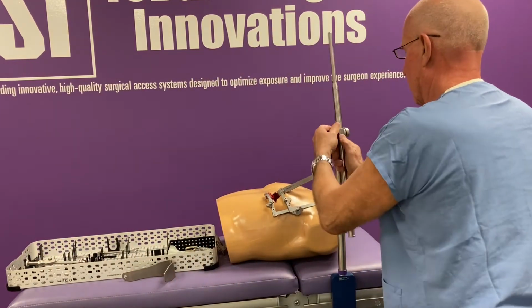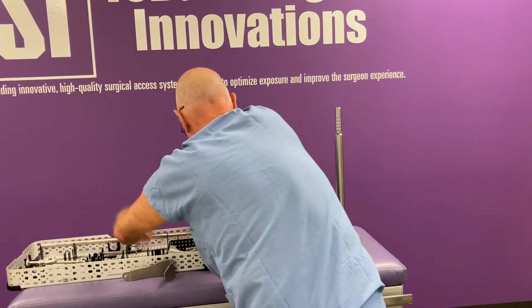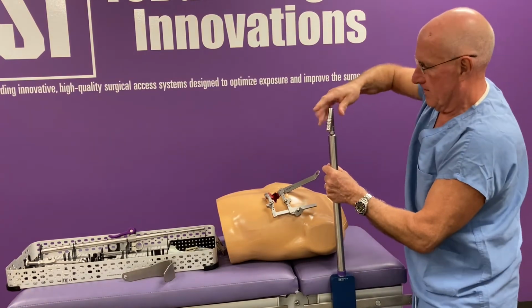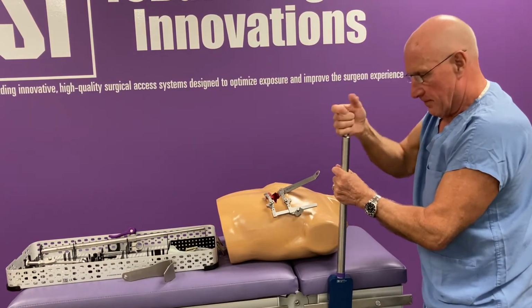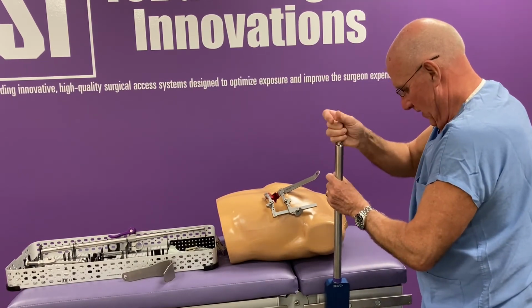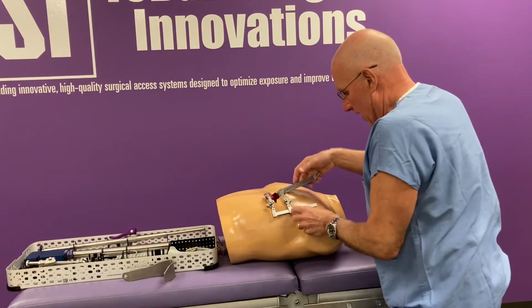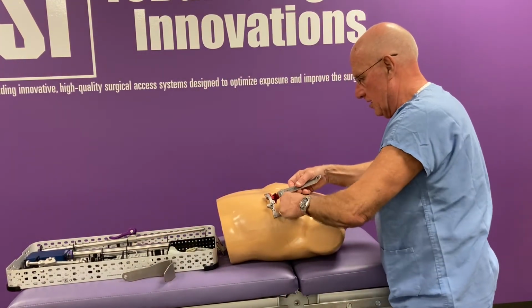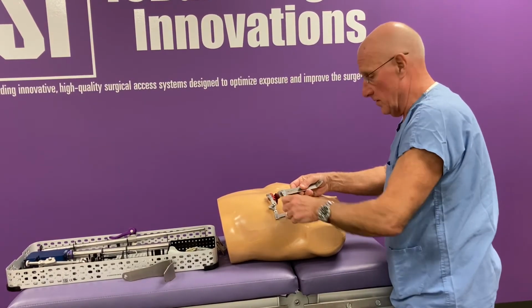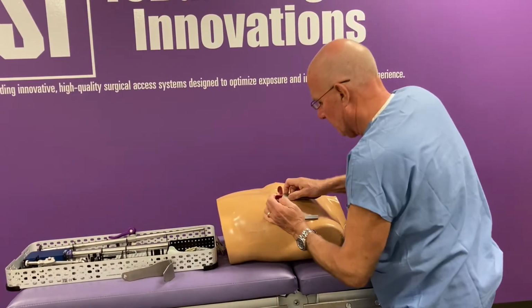Take the extension arm off. I'm going to go ahead and lift the lever again so that we have the torque to be able to loosen it enough to come off the table rail, okay? See how quickly this assembles and disassembles. Now we're actually going to unpivot this. You can also use the pivot tool that's included with the retractor. Then we're going to go ahead and take this one out.